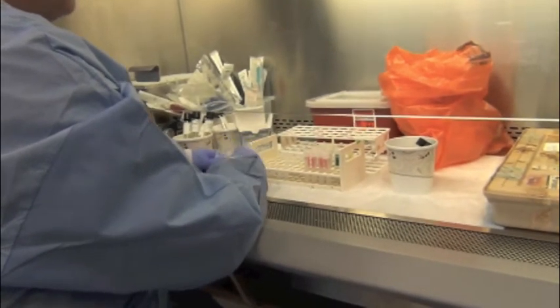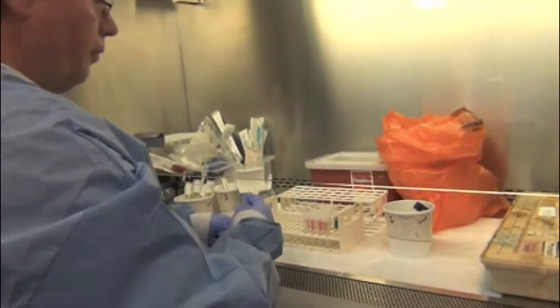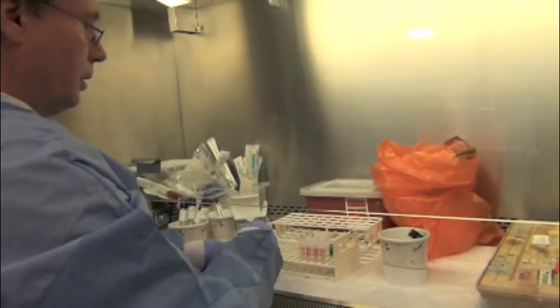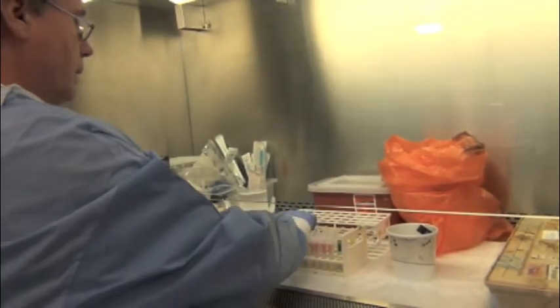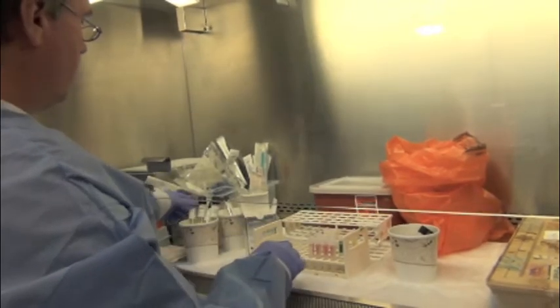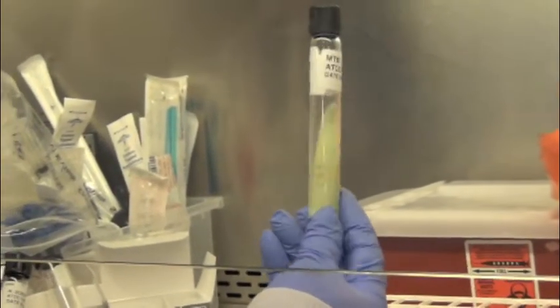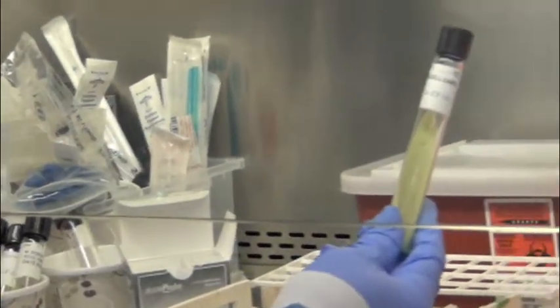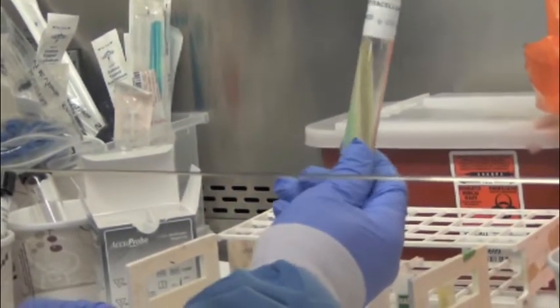We also have control organisms that we have to run. For the TB probes, our positive control is Mycobacterium tuberculosis. Our negative control for the TB probe would be Mycobacterium intracellulare, or Avium intracellulare. We call it MAI.